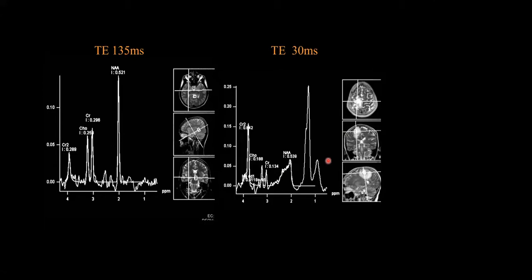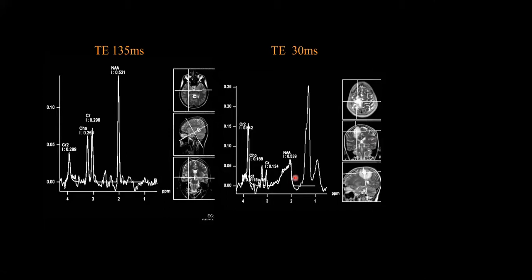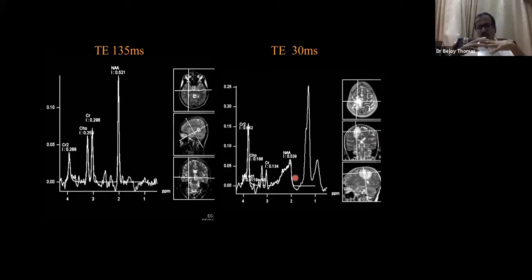Glutamate and GABA are one of the few neurotransmitters, not metabolites, neurotransmitters, which you can actually study with H1 spectroscopy. This is really important to know, because to study the neurotransmitters at normal concentration, usually GABA and GLX, the glutamate, you need at least 0.5 micromoles per gram of tissue of these substances to accumulate in order to have a critical concentration to get detected by spectroscopy. You know that you have to suppress water and fat, and basically we are using only water suppression, and you are still seeing the fat there. And this is really important for our diagnosis.